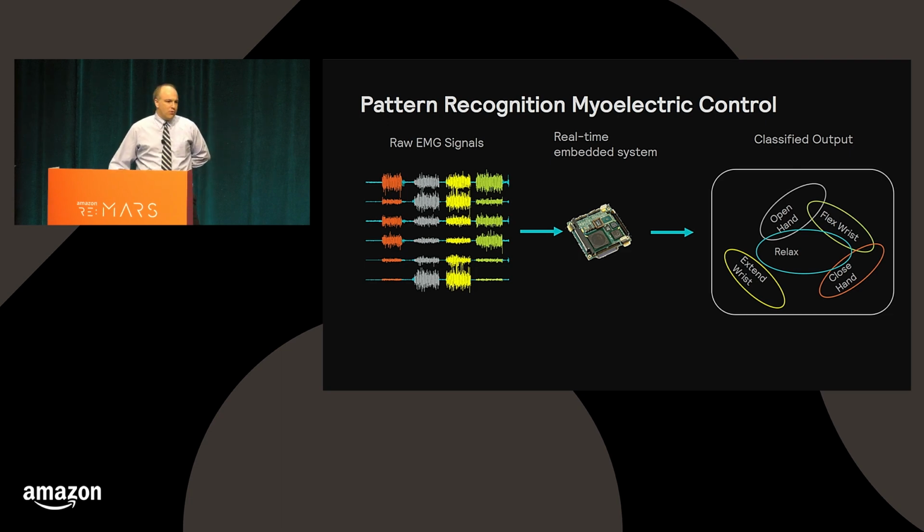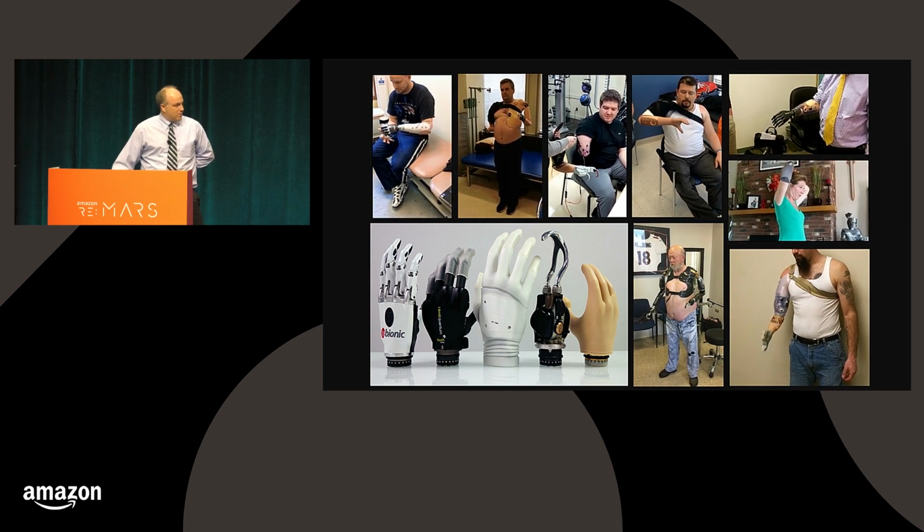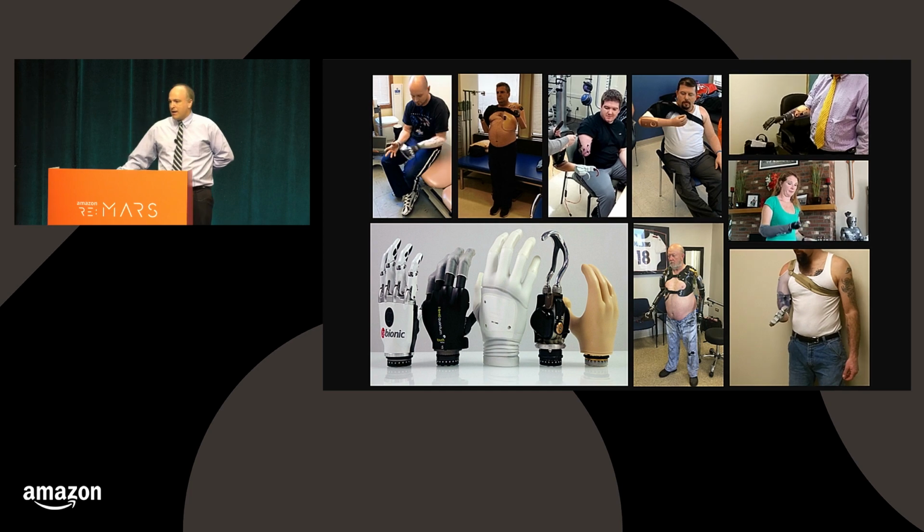And we use simple statistics like the amplitude or frequency content of those signals over a short time window to make that transformation. After they've been transformed into a feature space, you can use any number of machine learning algorithms to partition that space. We use support vector machines, mixture models, neural networks, deep networks. Name your favorite classifier, and someone in this myoelectric control industry has probably tried it with some degree of success. And these aren't just in the laboratory anymore. These are, in fact, available to patients around the world. So these are examples of real upper limb amputees using bionic arms. A number of very nice hands, hooks are available.